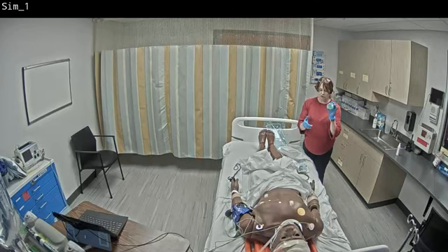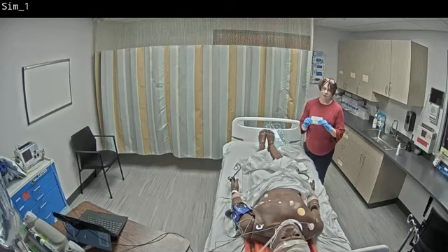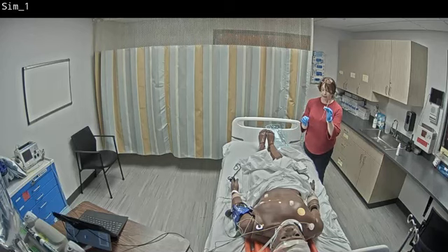We have a sterile specimen cup, we have waterproof drapes, and I do have labels on all of these. Usually, this helps especially our students that are in the beginning stages of their nursing program. It helps them to realize the difference between fenestrated and waterproof drape. Here's my lubricant. It's in there. I can use it with my intermittent catheter.